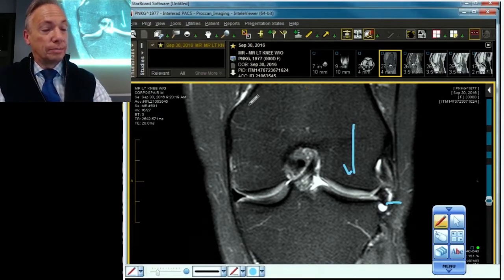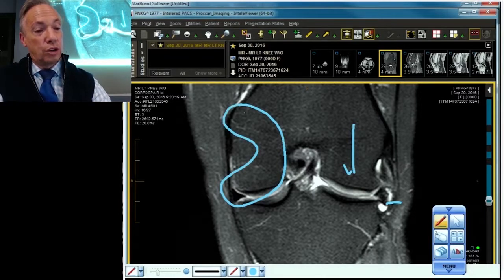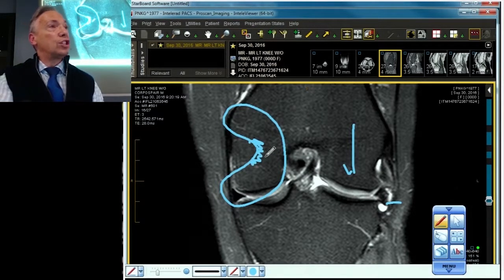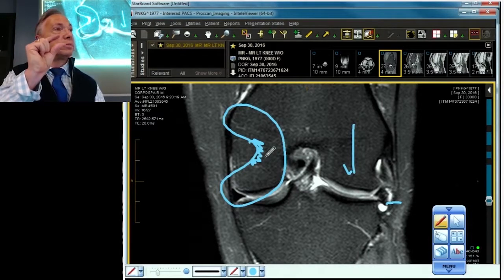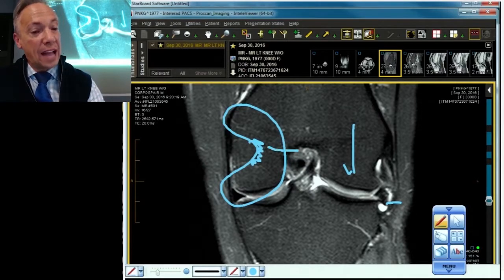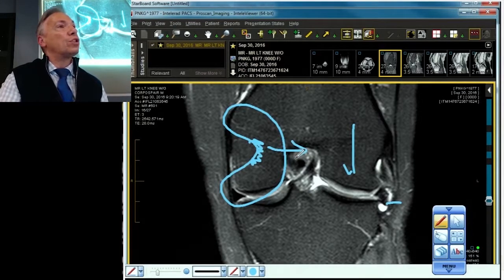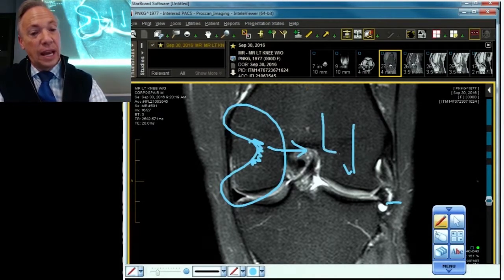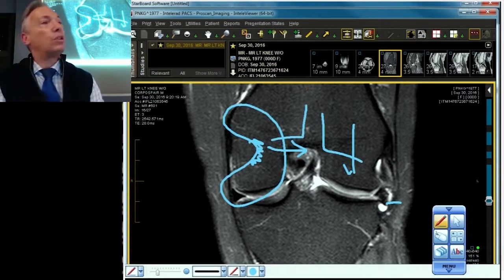Why did this occur? Because the meniscus got chopped right here. Now when you drive the femur down into a structure that is paper thin, irregular, and has lost some of its depth, you know from physics that produces a scenario enhancing the pushing effect of the meniscus to one side. Most of the forces are coming down and out on both sides.